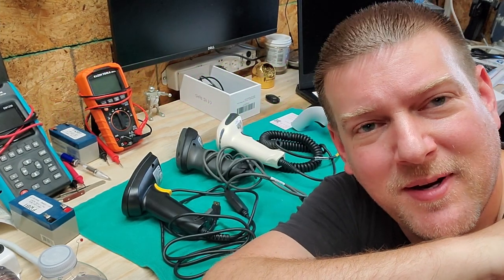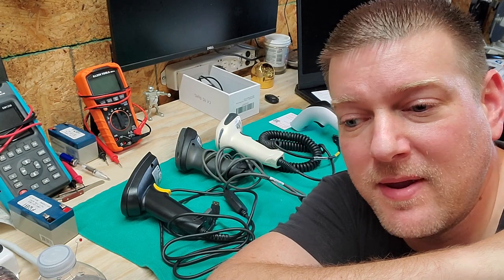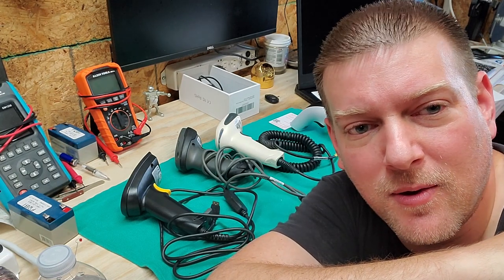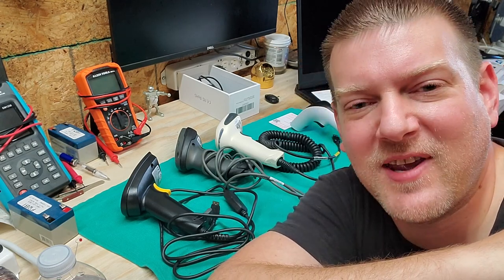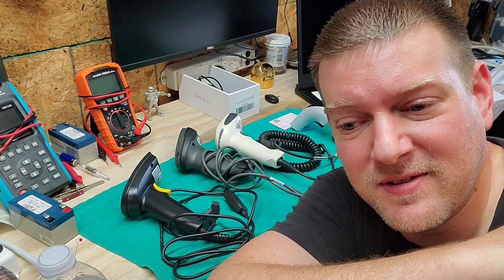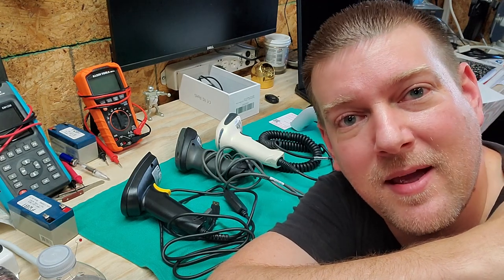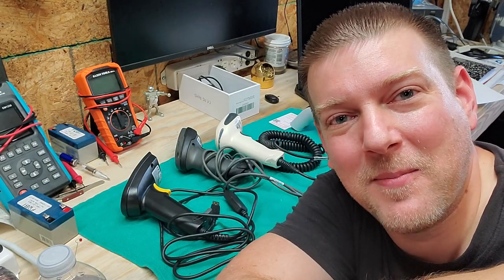These little devices right here can change your life as a biomed and make your day go a lot smoother than if you had to type everything in. We're going to cover barcode scanners — not the most exciting topic, but I guarantee if you listen to what I have to say, it might change the way you do business and make your life a little bit easier. I'm Better Biomed.